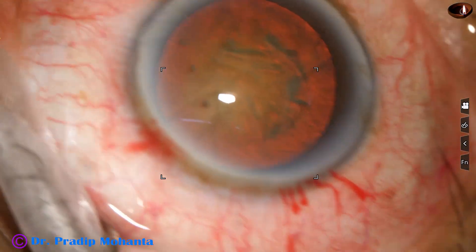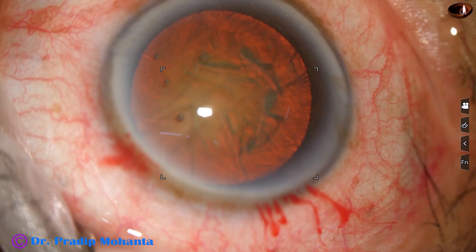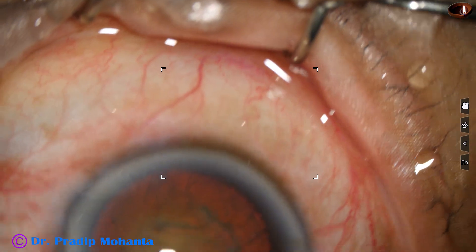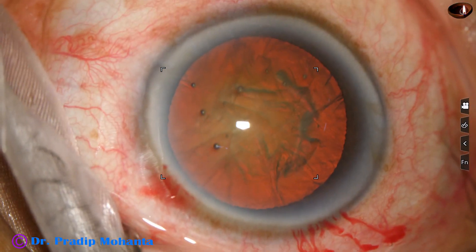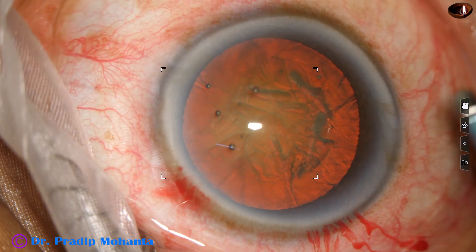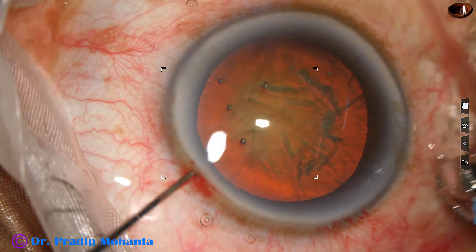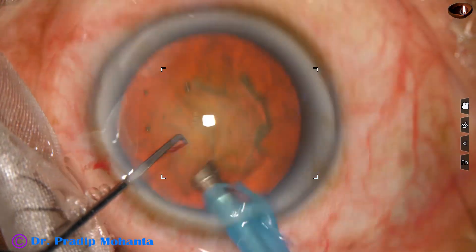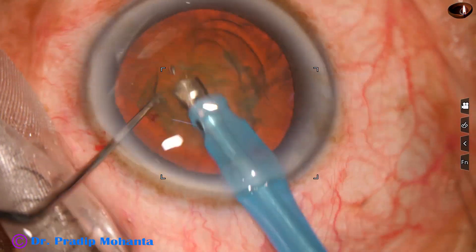Now is the time to use the phaco needle. The machine being used is Infiniti from Alcon, Switzerland. The phaco needle is introduced into the anterior chamber. Sometimes we have to rotate the handpiece to get it inside the anterior chamber.